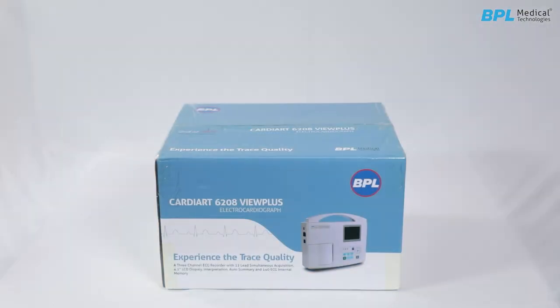Introducing BPL Cardiart 6208 View Plus. Welcome to the guide for unpacking and operating the BPL Cardiart 6208 View Plus.